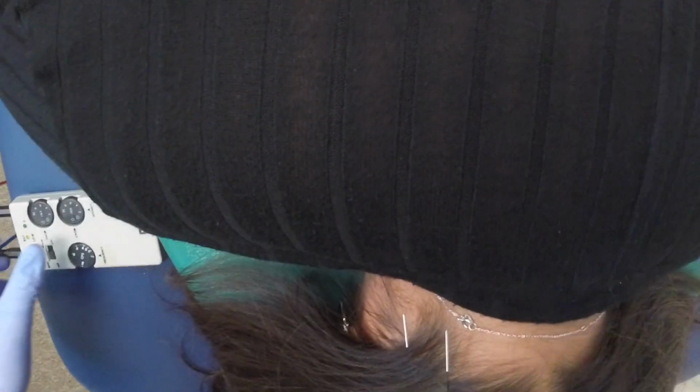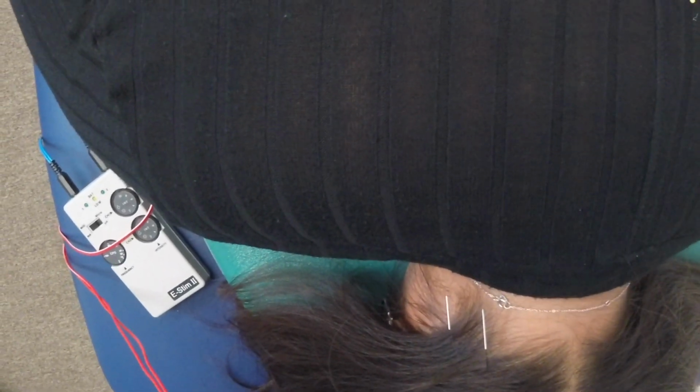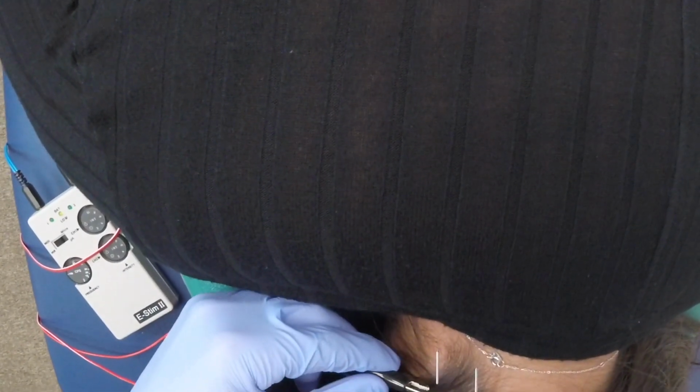A lot of great benefits of dry needling that we'll talk about here in a sec, but what we're going to do is hook up the electrical stimulation. And I love using electrical stimulation. It's kind of an adjunct to the needling itself, and it can really enhance the treatment, increasing blood flow, as well as that pain-relieving analgesic effect.